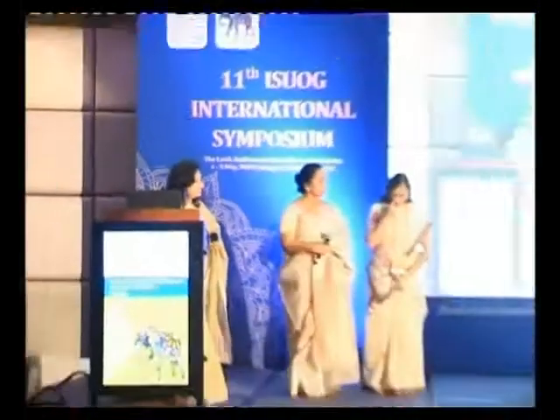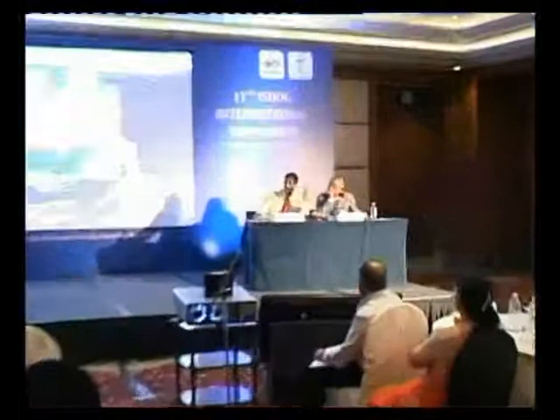One thing is very important here. You must understand that as a radiologist, sonologist or gynecologist, when you comment upon that, it is the most dreaded thing which we can find on an ultrasound, because once we want to do an embryo transfer, our catheter will get stuck at that particular point. So you must look at such Nabothian follicles or any cysts which you find there, and map them. When you report, map them properly and draw something so that the gynecologist knows that there is a problem.